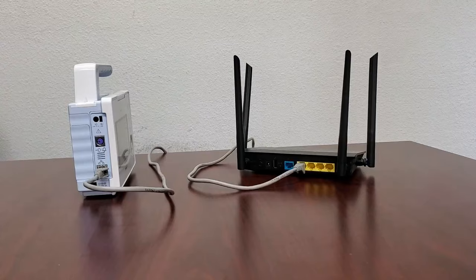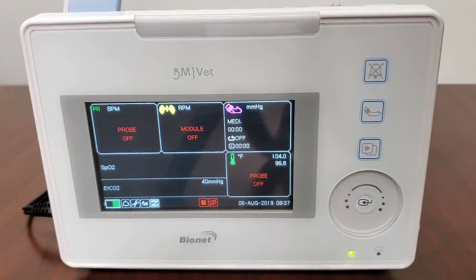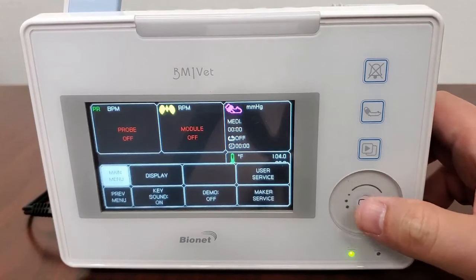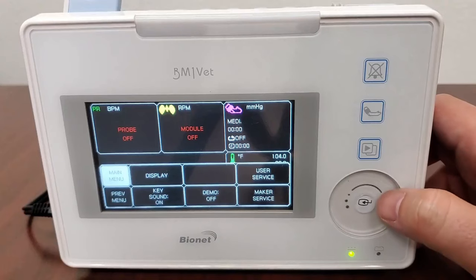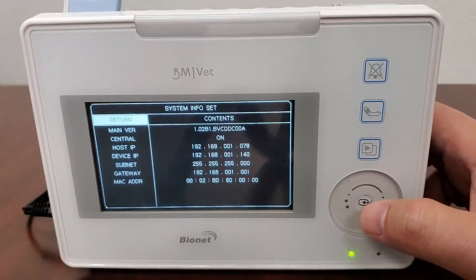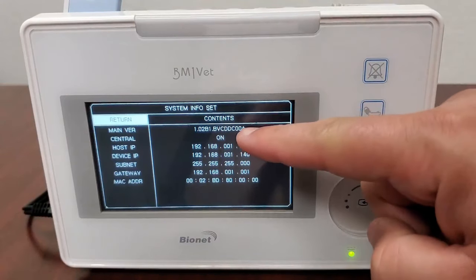Let's now establish the connection parameters on your BM1 VET. From the main screen, use the touch wheel to highlight the wrench icon and press the Select key. Wheel over to User Service, select, and then wheel over to System and select. In this menu, ensure that Central is set to On.